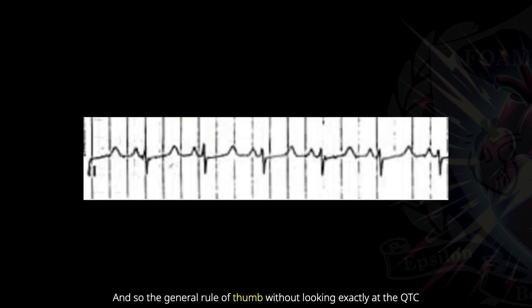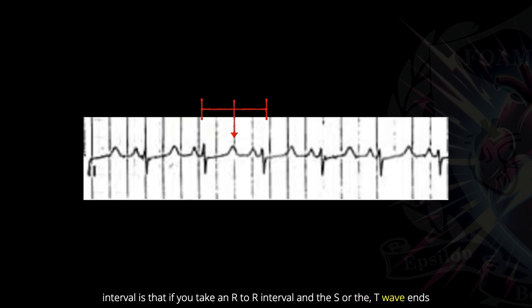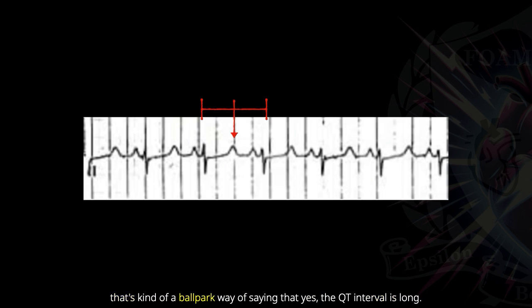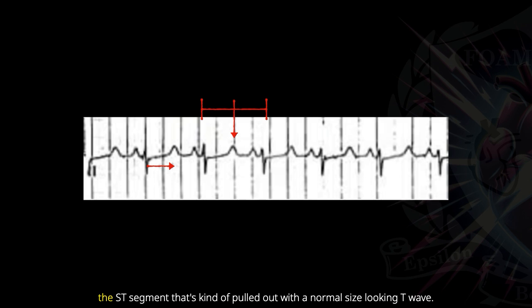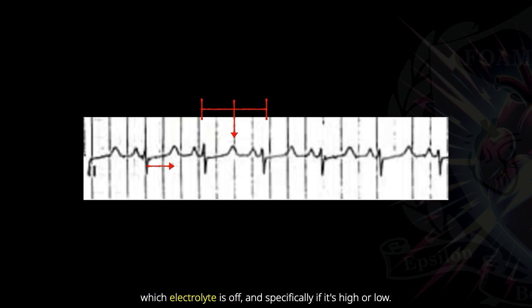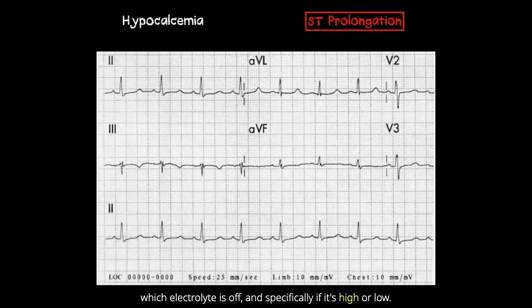The general rule of thumb, without looking exactly at the QTc interval, is that if you take an R-to-R interval and the T wave ends up being at or beyond the halfway point between the R-to-R intervals, that's a ballpark way of saying the QT interval is long. What I want you to notice about this specific portion is that it's actually the ST segment that's pulled out with a normal-sized-looking T wave. This is important because it's going to delineate exactly which electrolyte is off and specifically whether it's high or low.